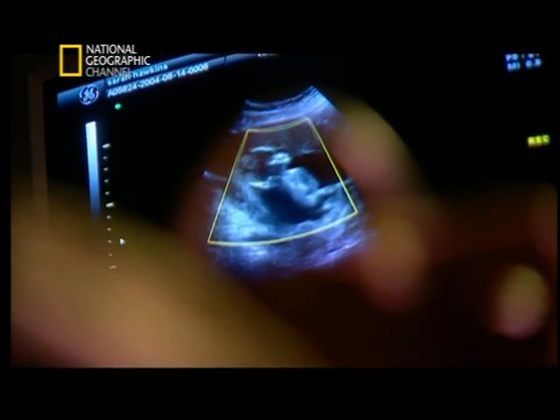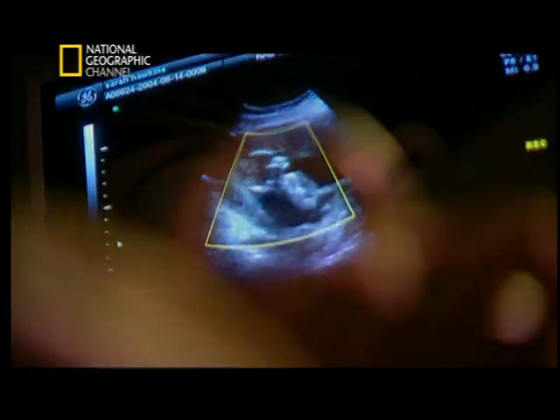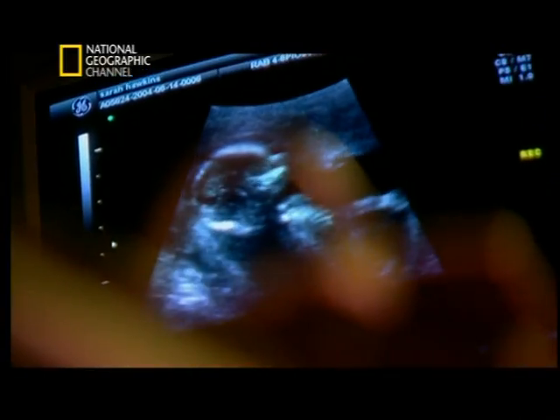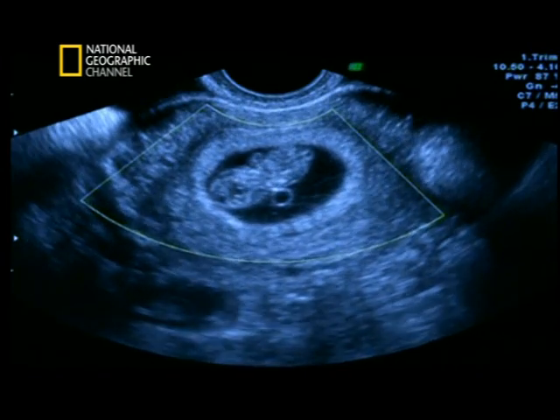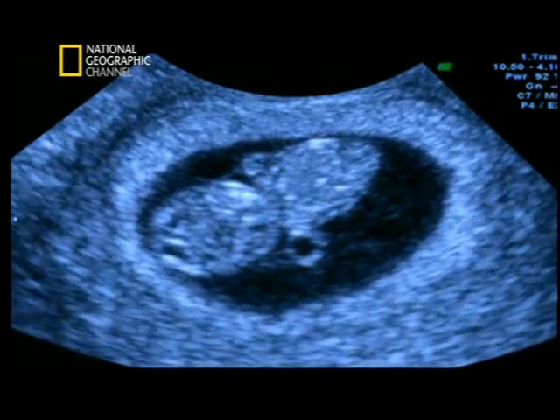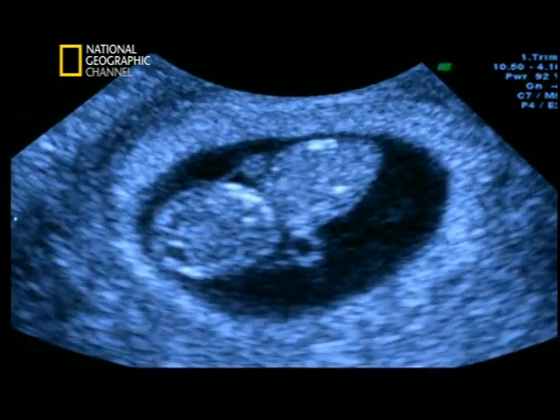Now, just do the nuchal translucency, because you haven't had that test, okay? The scan can also show early, but not conclusive, diagnostic features pointing towards genetic abnormalities. No, that's a test for Down syndrome. Now, it doesn't definitely say the baby's got Down syndrome or not, but it tells you if you're at risk.